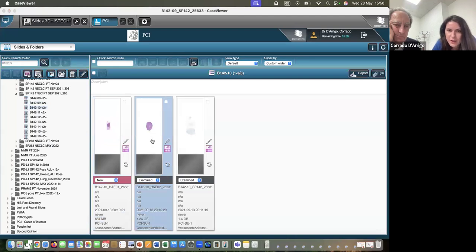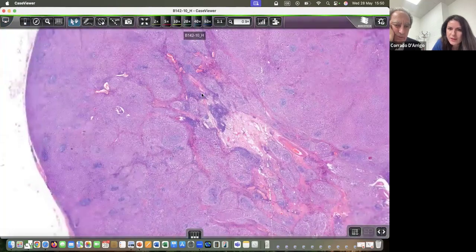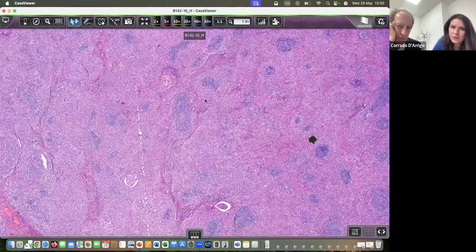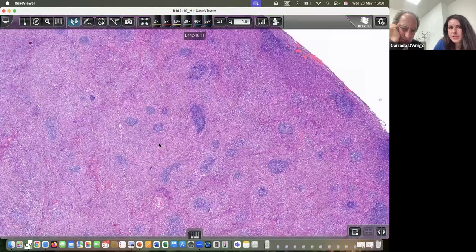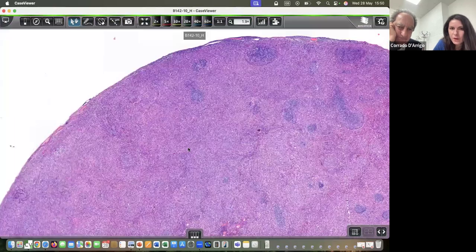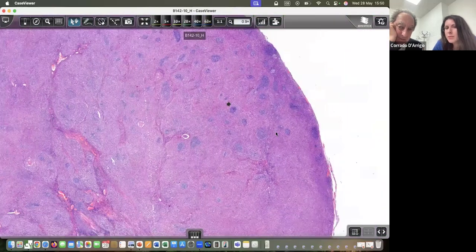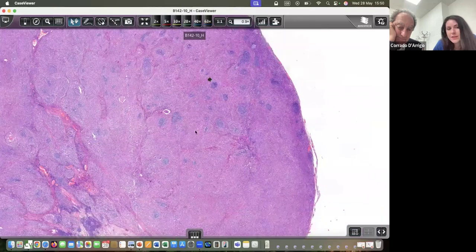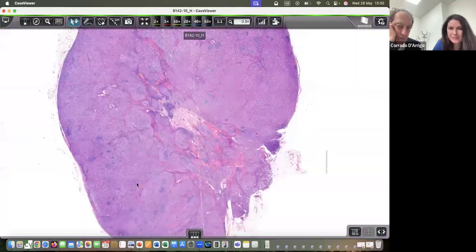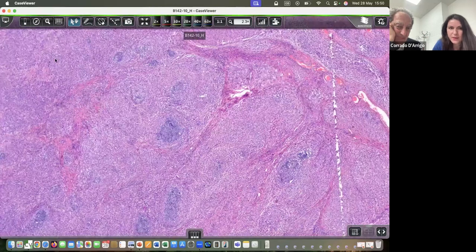Wow. Now we have an extra H&E, or maybe we put both. Lymph node. Wow, this is interesting. Yeah, this is all tumor with a few lymphoid. Now, this is one of my questions. If it stains only these, you would still not take it into account, because these are definitely residual, aren't they? I mean, they're probably. Are they? They could be reactive as well to the tumor. It looks as if there is very little residual lymph node here. It's just that some carcinomas have these patterns of metastasis.